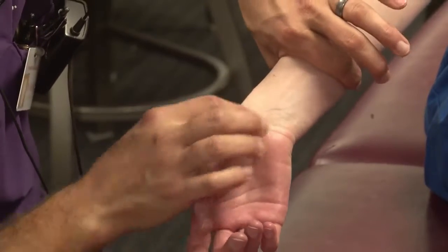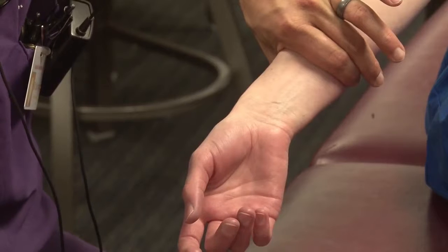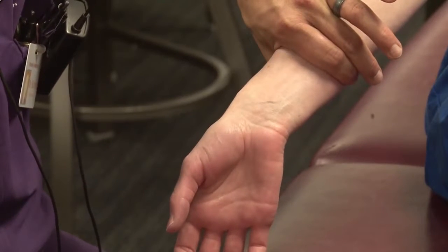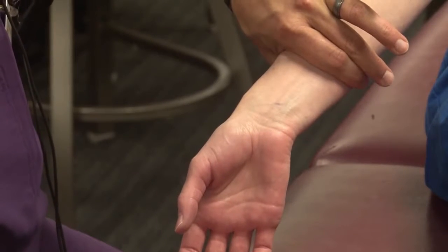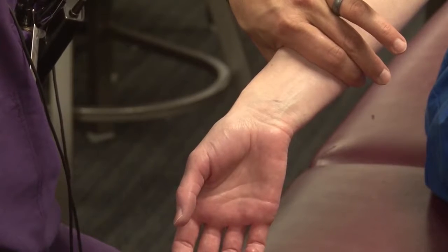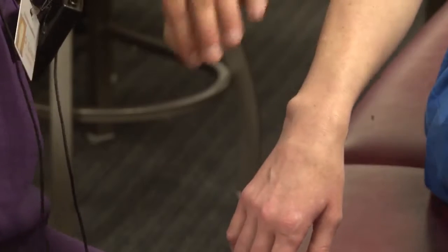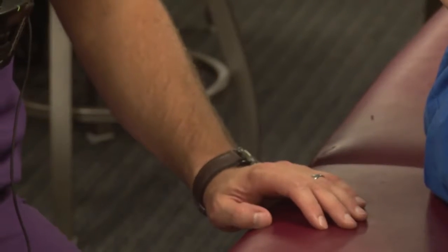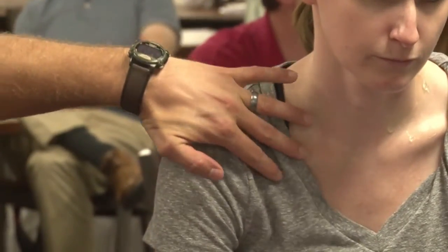There are usually some nice ones here on the underside of the wrist. They usually don't get used either. They're tender, that's tender meat there, so you may want to consider using some lidocaine to assist you. It may make your patient happier. Which ones am I missing, James? Older people a lot of times will have veins right up here on the shoulder. They're not easy to hit, but they do exist.